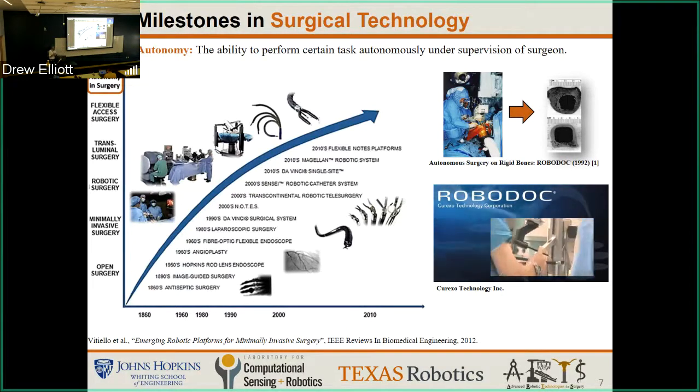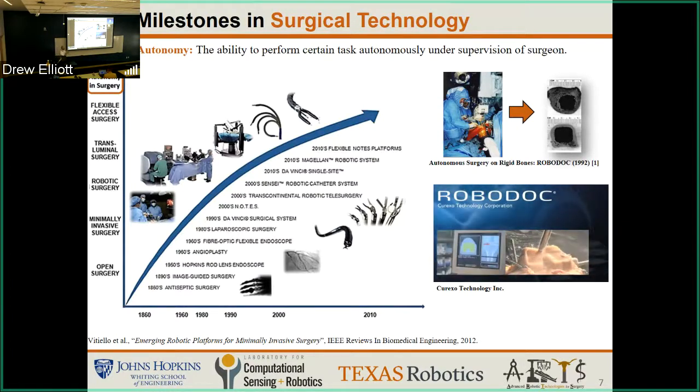So surgical autonomy, you can see on the top right. That's Robodoc, like Peter is here. That's 1992. They did it perfectly with Robodoc. They did, I guess, total knee, right, Peter? Total hip first. You see here what surgeons do in the OR without the robot, and here you can perfectly command the robot to machine and cut a bone. Why can you do it? Because it's a hard tissue, so you can pre-plan and then command your robot to go and cut.